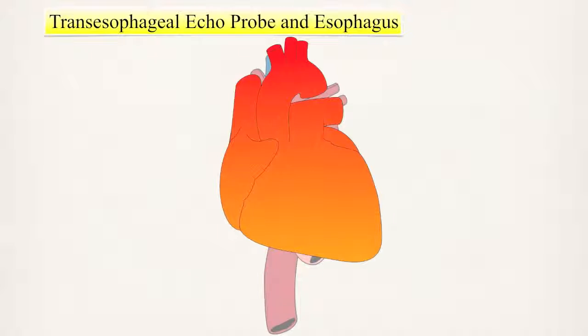We have already evaluated the relationship of the aorta to the esophagus, so we will now turn our attention to the relative position of the heart. The heart lies in a position in the chest which is just to the left of midline and angles anteriorly and inferiorly from base to apex. The right atrium and ventricle are on the patient's right, which is on the left on the slide.